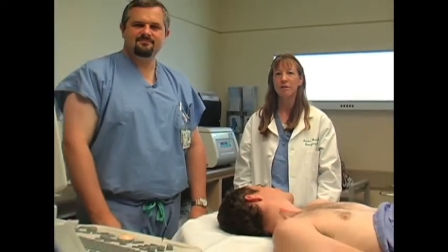Hi, I'm Sandy Werner, and this is the Access EM video for cannulation of the internal jugular vein using ultrasound guidance. And this is Dr. Dan Haggerty, who will be performing the procedure.